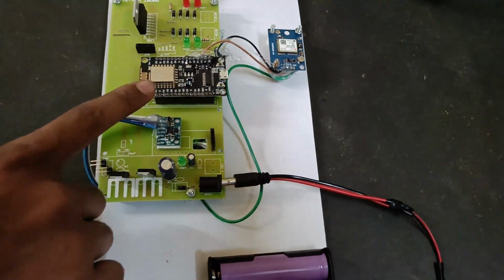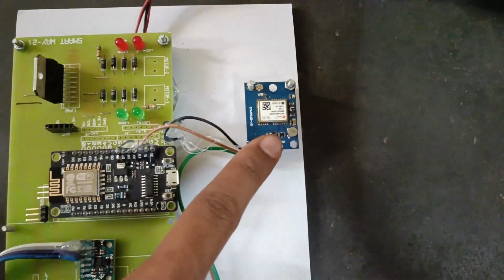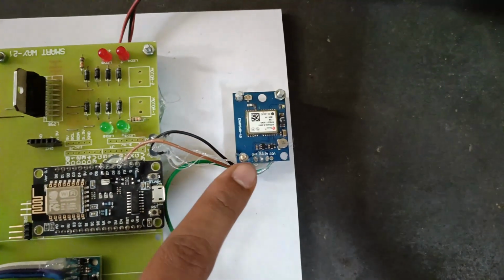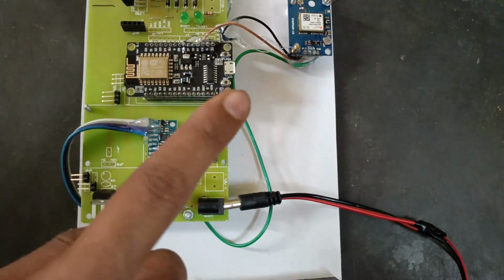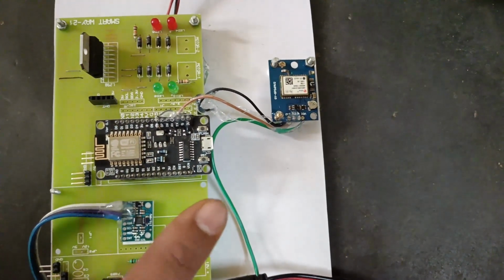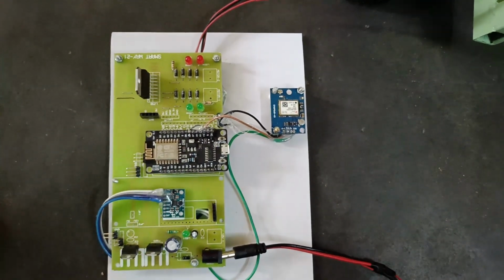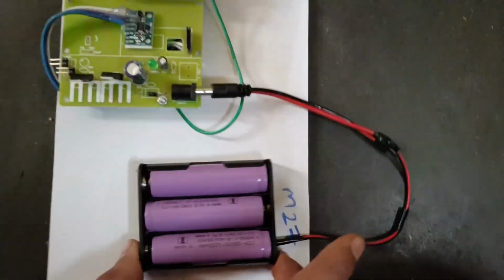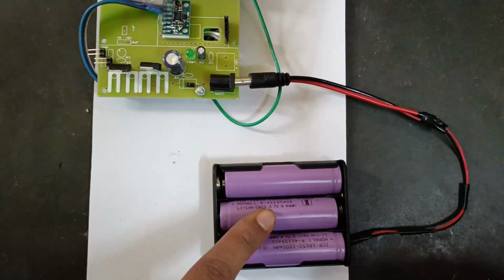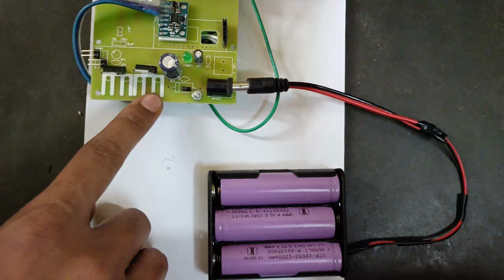The NodeMCU microcontroller will get the GPS location of the wheelchair, the latitude and longitude data. The data will be sent to the Blynk IoT application, and the caretaker will get an alert notification with the latitude and longitude coordinates of the wheelchair. The power supply is provided by a 12-volt lithium-ion battery, along with a step-down voltage regulator.